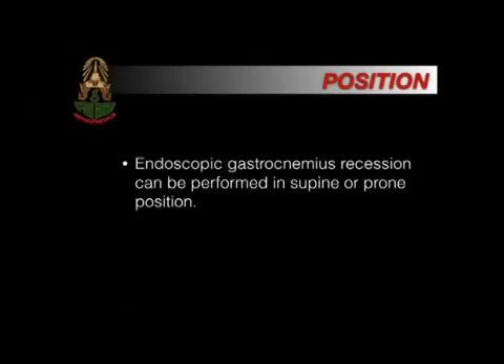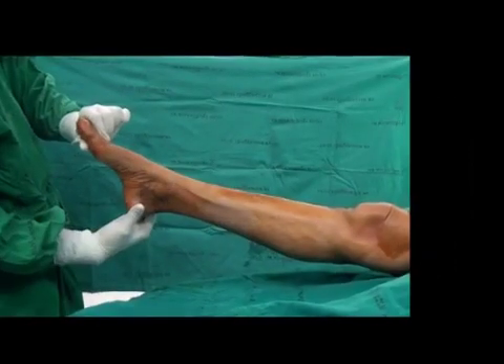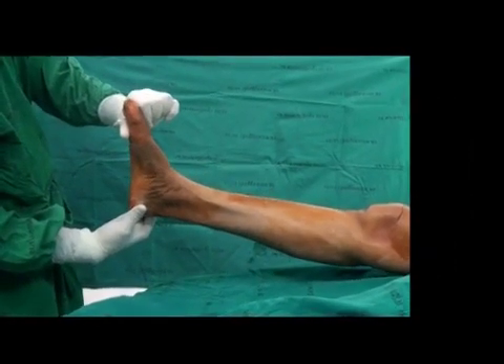Positions: this surgery can be performed in either supine or prone positions. In this video, the patient is placed in the supine position.